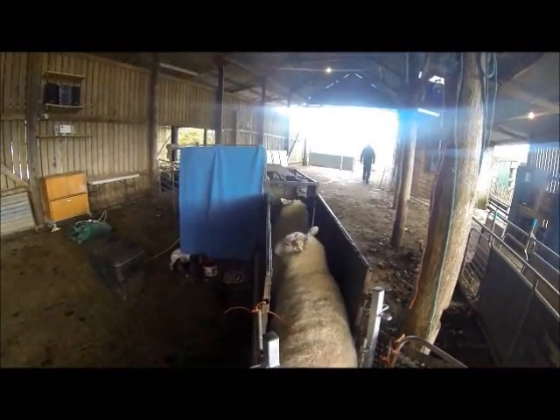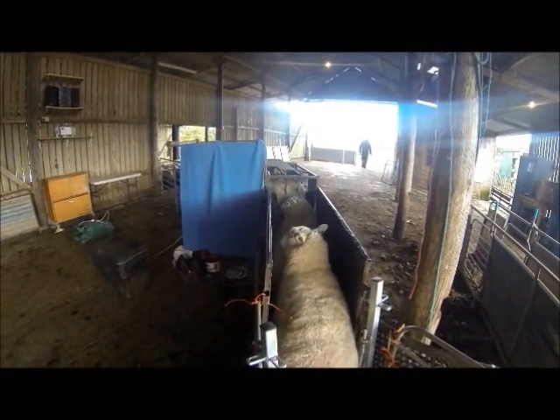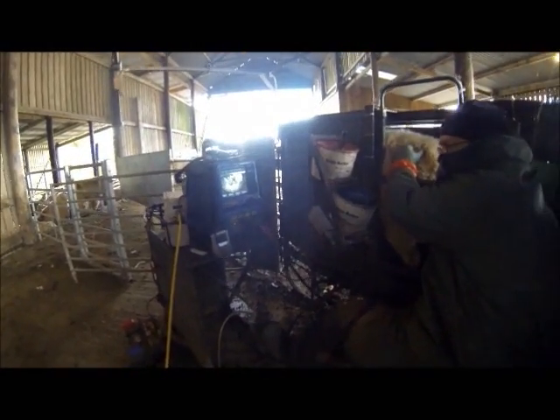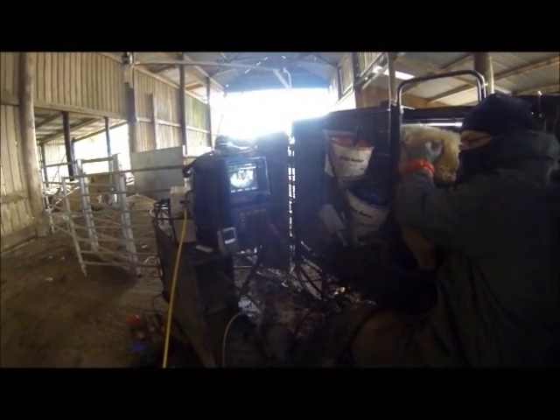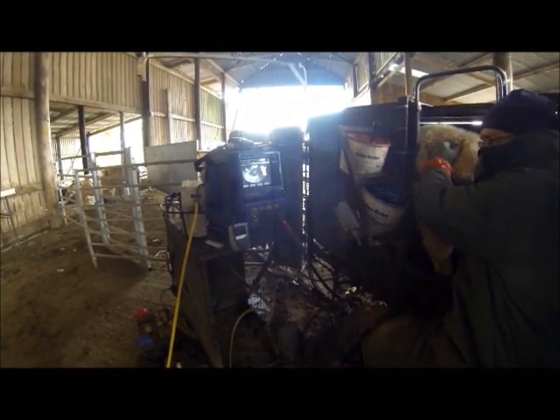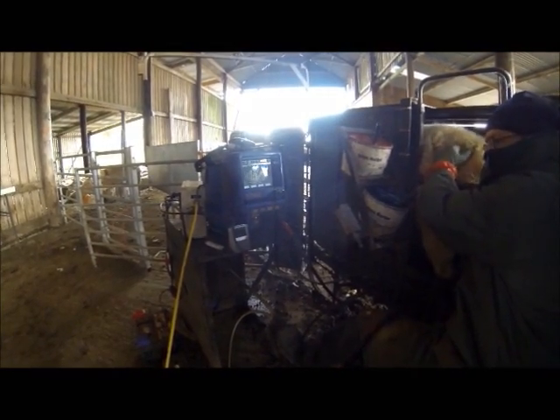Back in the sheep pens, the ewes await. They will run up the race and into a crate. Here the scan man uses his pregnancy scanner to show an image of the ewe's uterus and what's inside — plenty of lambs, I hope. A coloured mark is then applied to the sheep's wool to represent the number of lambs detected by the scan.